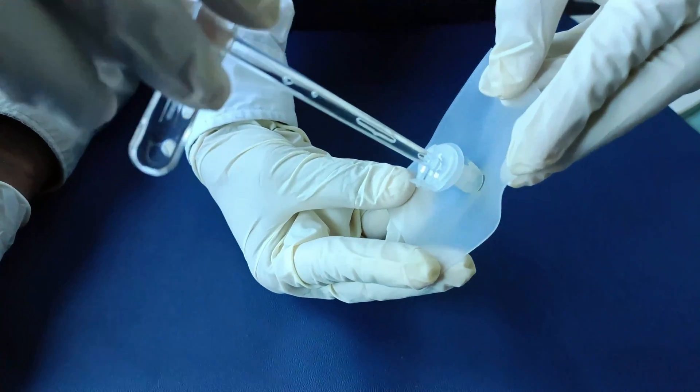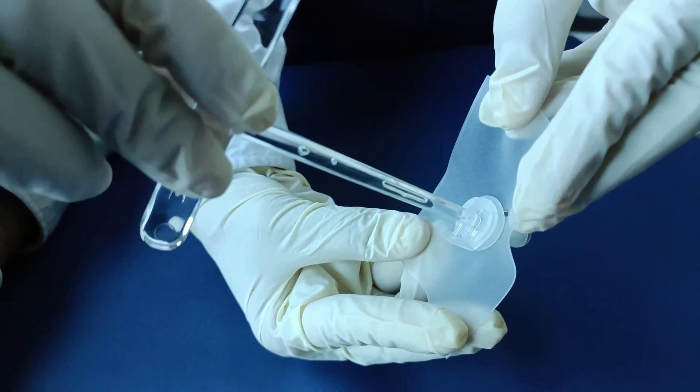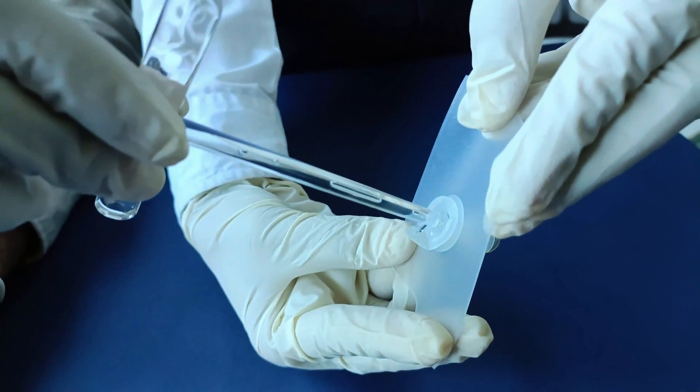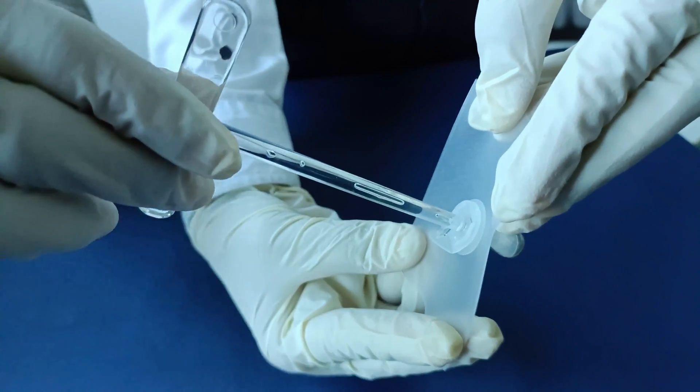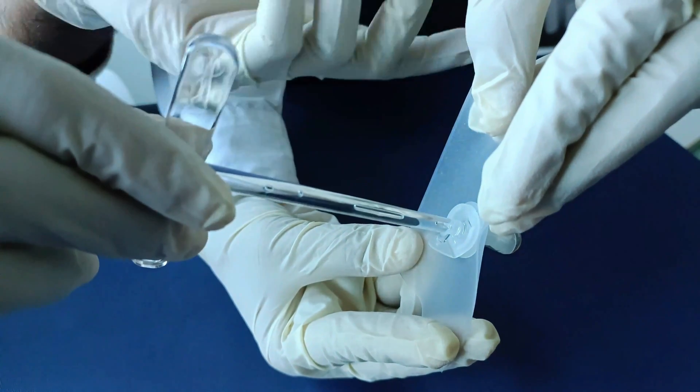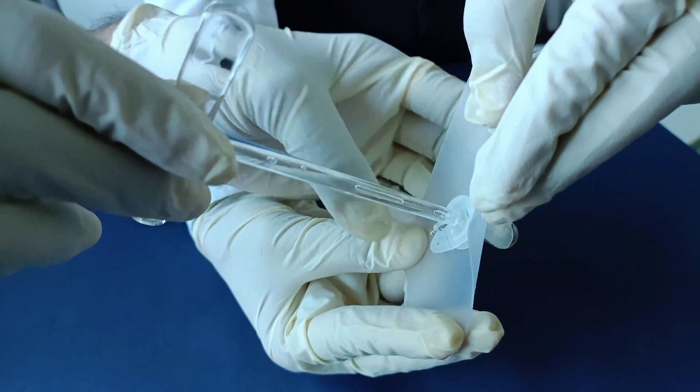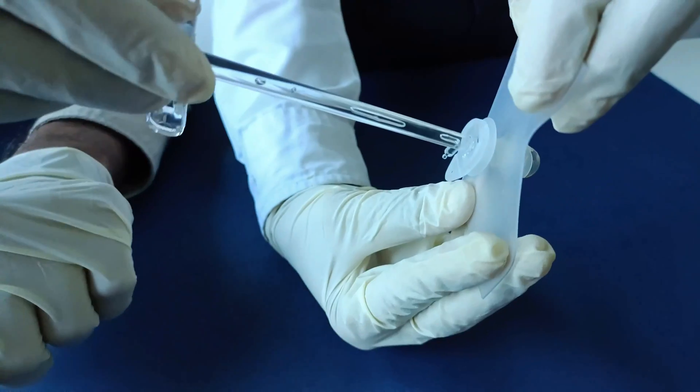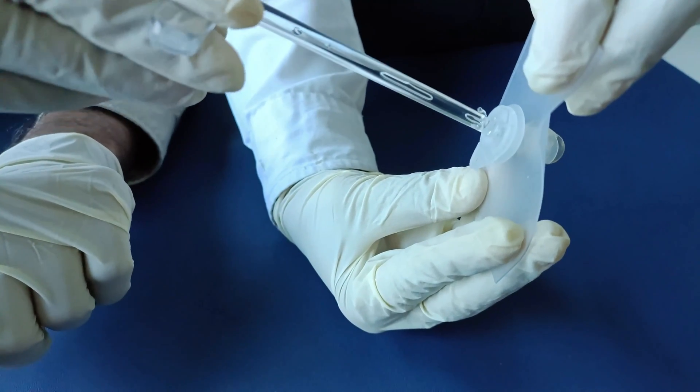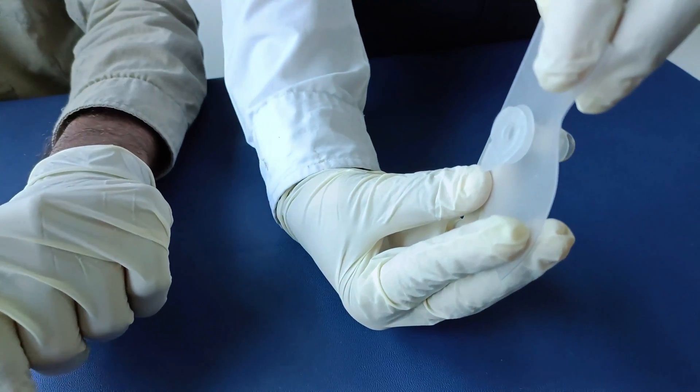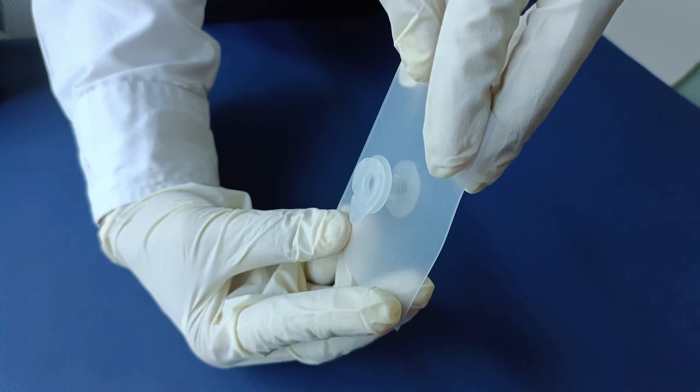With the outer cannula mounted on the inserter, insert the gel cap portion of the voice prosthesis outer cannula into the surgical puncture site until the gel cap portion intersects the inner wall of esophagus. Remove the outer cannula flange from the tip where it was fixed earlier and rotate the outer cannula inserter to 90 degrees clockwise for releasing the locking mechanism and pull out the outer cannula inserter.